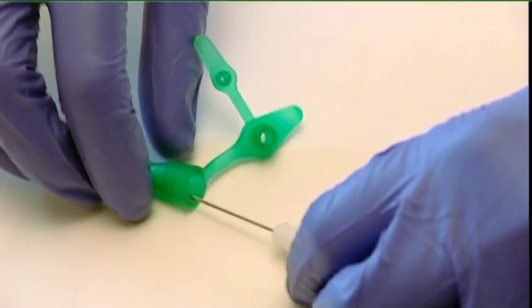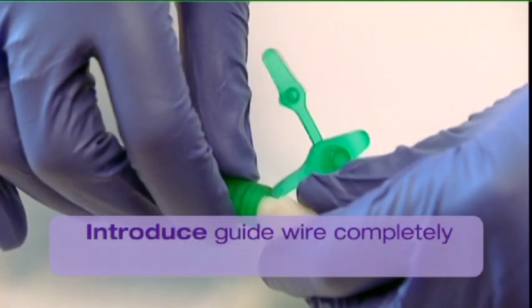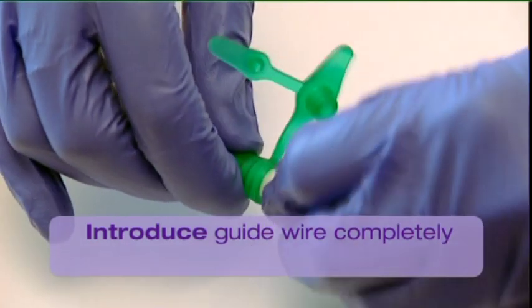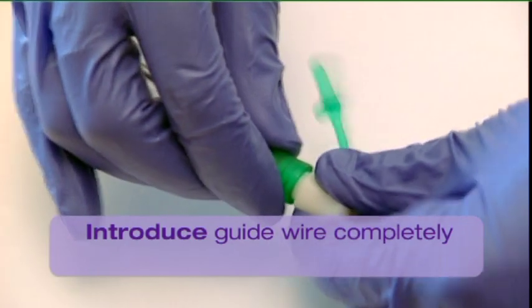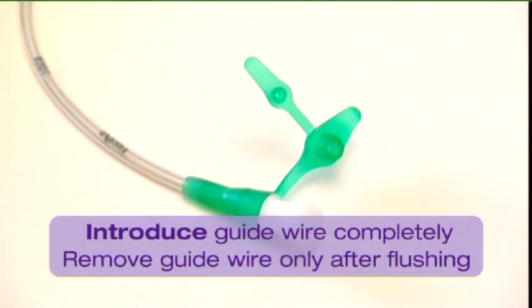In case of using a tube with guide wire, introduce the guide wire completely into the tube prior to placement by pushing the handle of the guide wire completely into the large opening of the feeding connector. Remove the guide wire only after flushing the tube.